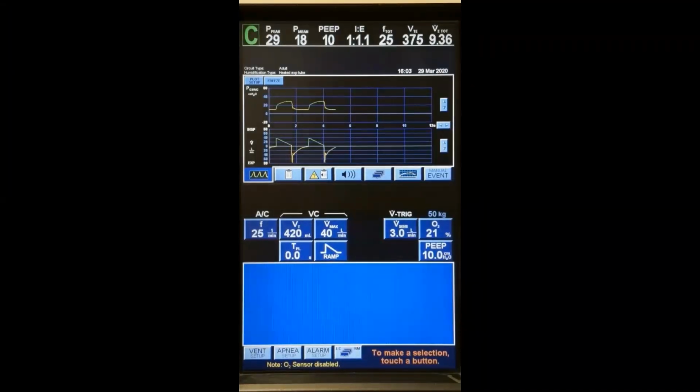All right, so now that the patient has been sedated and paralyzed, they will be receiving all controlled breaths. The rate is set at 25 to normalize the CO2, and our peak pressures are within an acceptable range for this particular patient. Since this is right after initial proning, you won't see an immediate change in peak pressures from improvement in compliance, and you will most likely see a drop in saturations, and it will slowly increase over time. But since this is right after the proning process, this is typically what you would see.